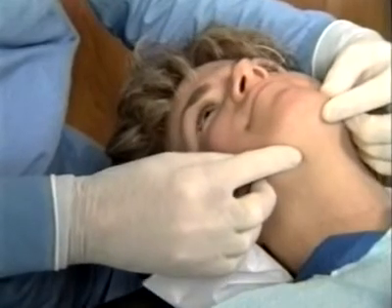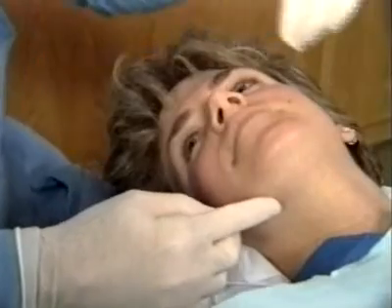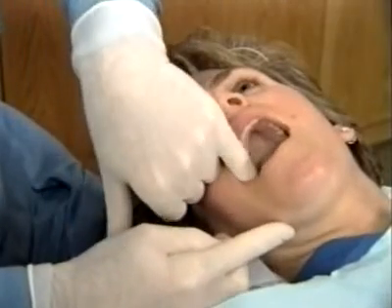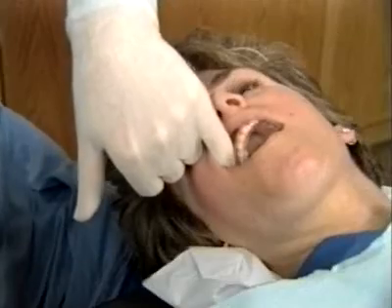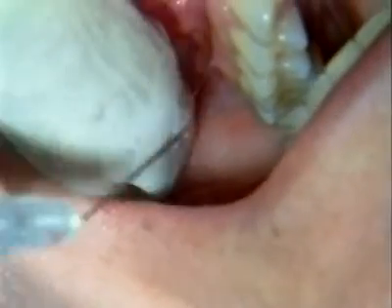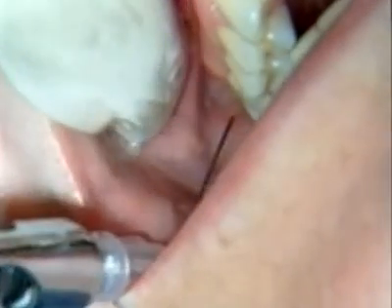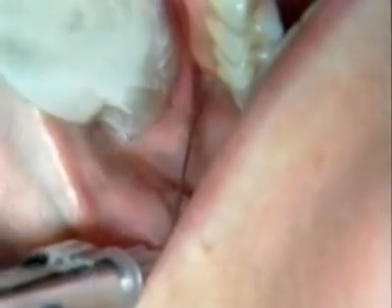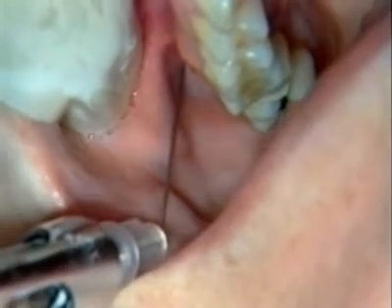The patient's neck is extended and the head turned to permit visualization of the buccal vestibule. A finger is used to palpate the zygomatic process. The mouth is partially closed and the jaw is shifted toward the site of injection. With the palpating finger placed over the zygomatic buttress, the needle is carefully moved into position.